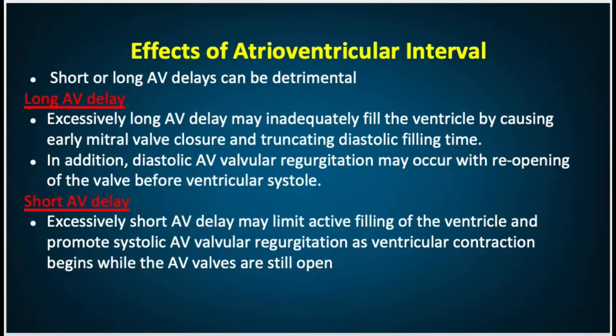Effects of AV interval. The presence of a consistent AV relationship does not assure optimal hemodynamics as described. Some relationships are detrimental, as with 1:1 VA conduction. Similarly, inappropriately short or long AV delay can be detrimental.